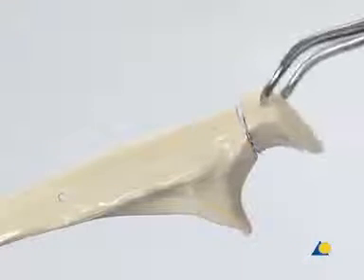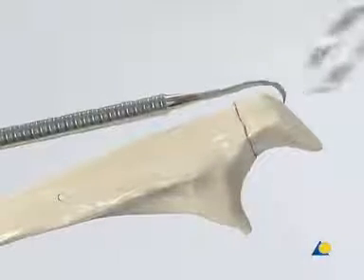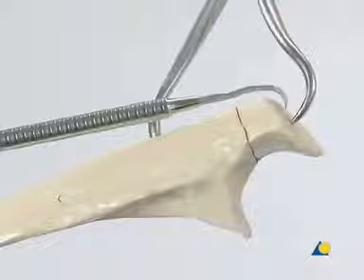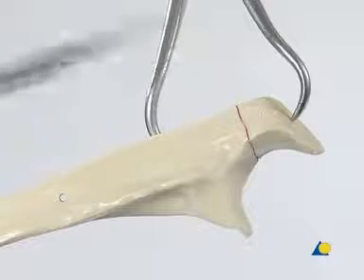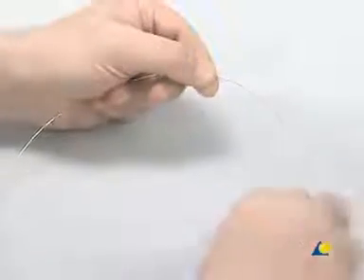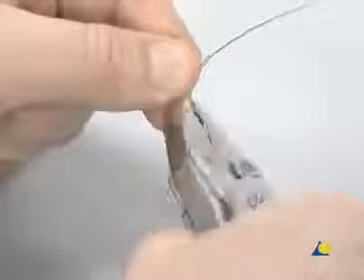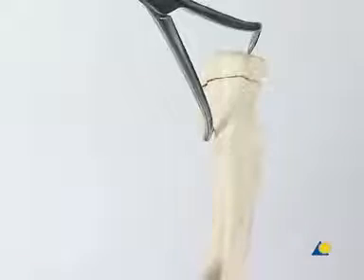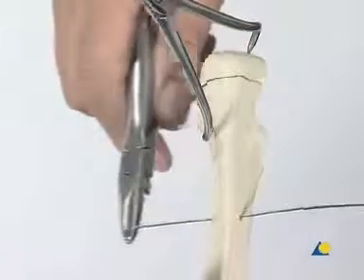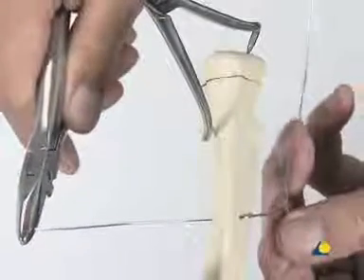The fracture is reduced with the large pointed reduction forceps. The fragment is held in the reduced position using the sharp hook. The forceps is then applied to the reduced fracture, making sure not to block the later insertion site of the K-wires. The hook is now removed. A piece of 1-millimeter cerclage wire roughly 50 centimeters long is cut from the coil. A loop is made by hand approximately one-third along the wire, then twisted with the flat-nosed parallel pliers. The shorter end of the cerclage wire is introduced from medial to lateral through the hole using the wire bending pliers. On the ulnar side, the wire is bent near the hole so that the prepared loop lies approximately 2 centimeters proximal to the hole.